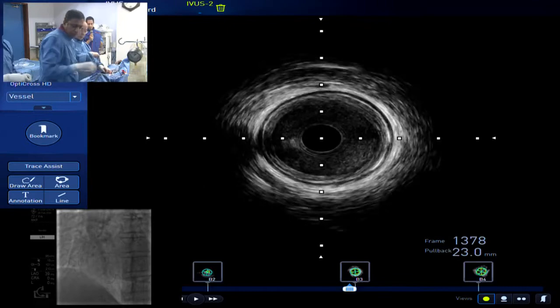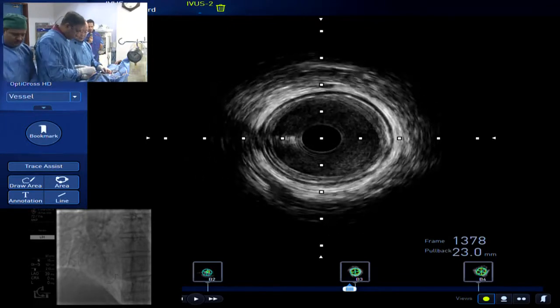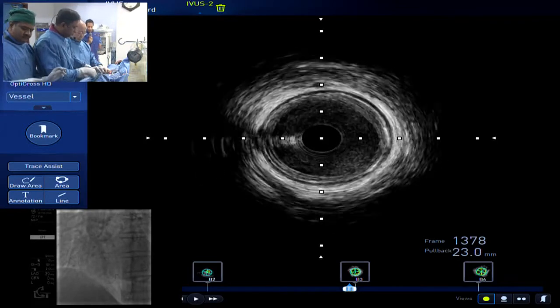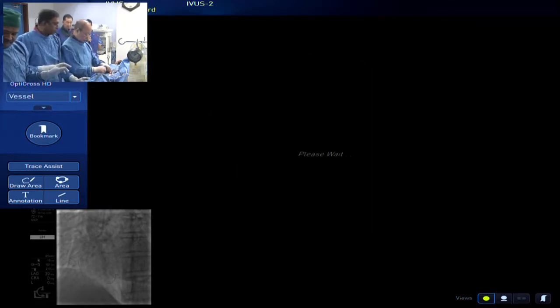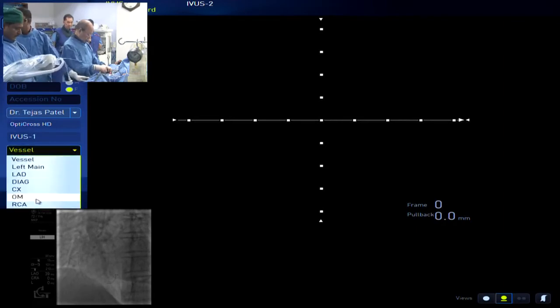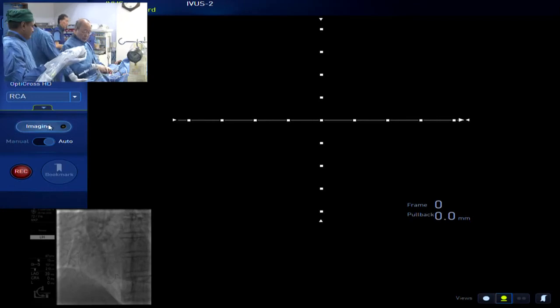It's just that low frequency event of a serious complication that concerns us. And we know from Aaron Grantham's registry data, and I hope he'll share some with us, that the major adverse event rate is not insignificant. For that reason, I feel that for now we should be monitoring patients a little closer. Tak, any comments on that?